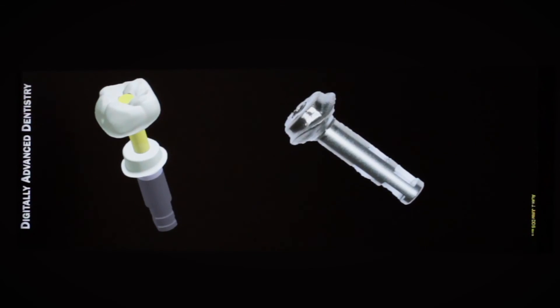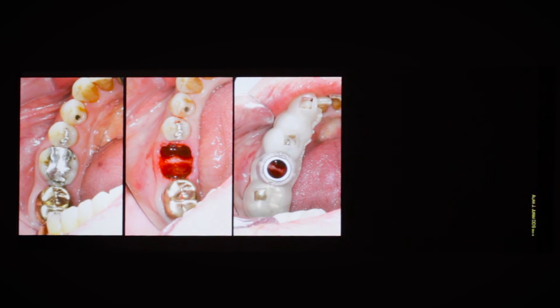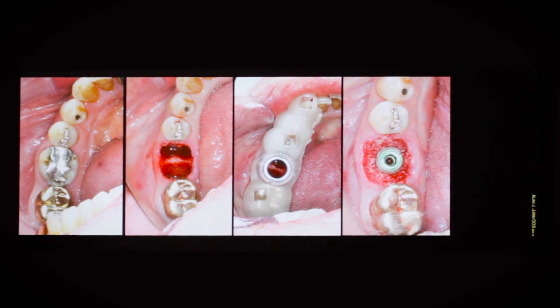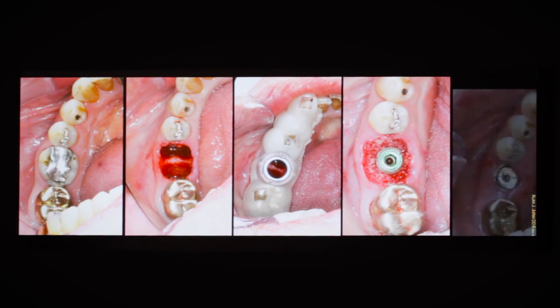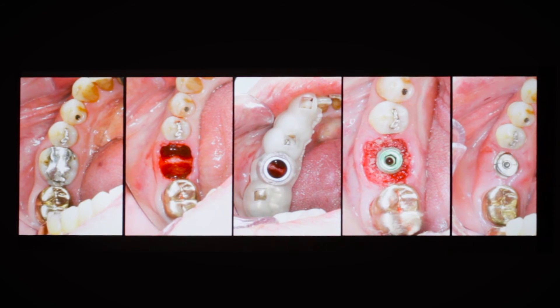So we have the tooth, we have the removal of the tooth, we have our surgical guide in place, and we have the final placement of the implant with the bone graft and the custom healing abutment in place around two weeks later.